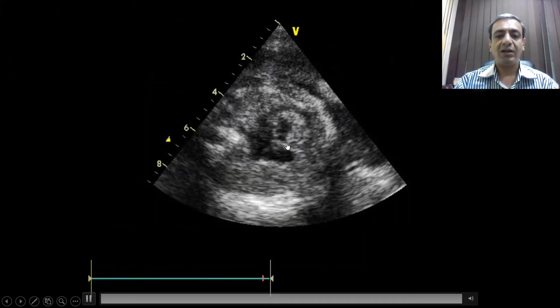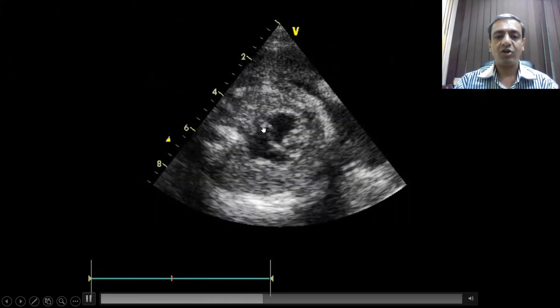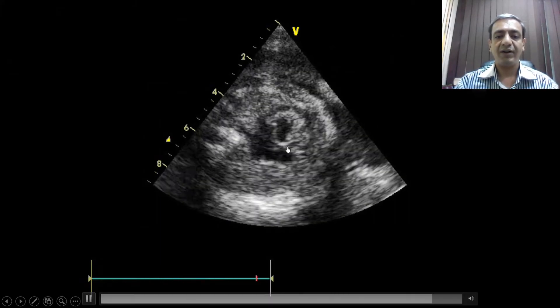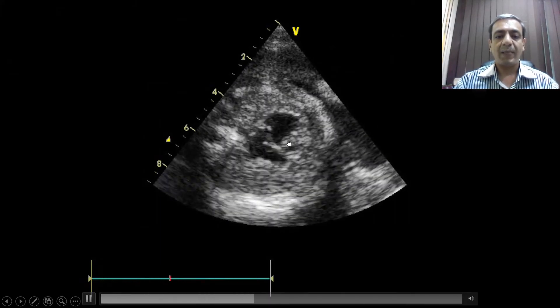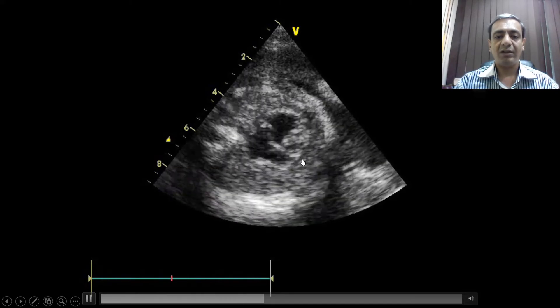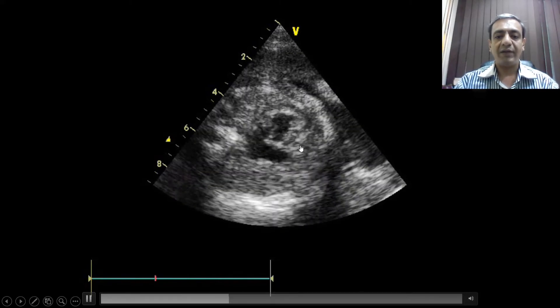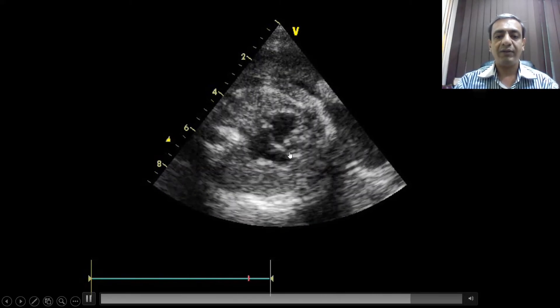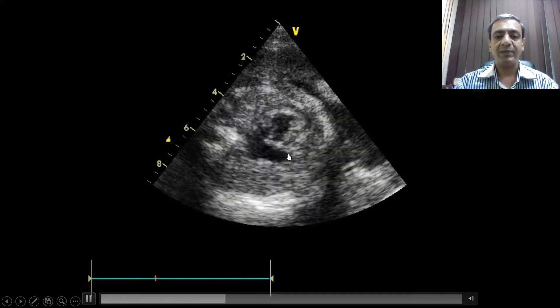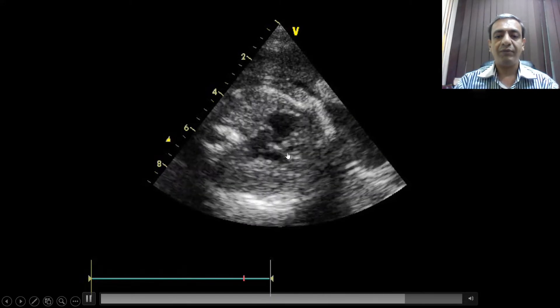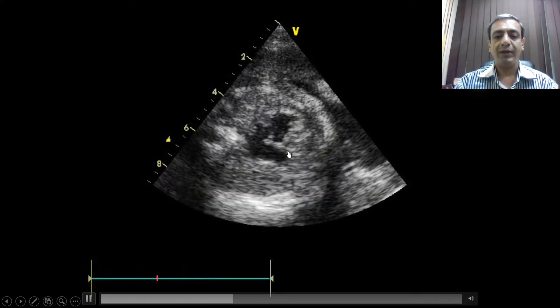Another heart showing a dominant left ventricle with a mitral valve. There is a small right ventricle with a very small tricuspid valve with only a few openings.